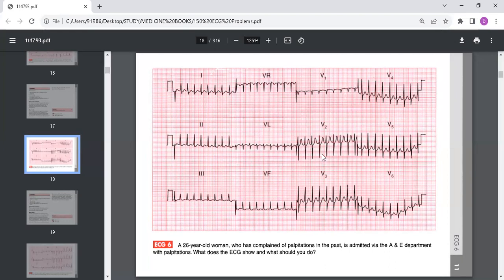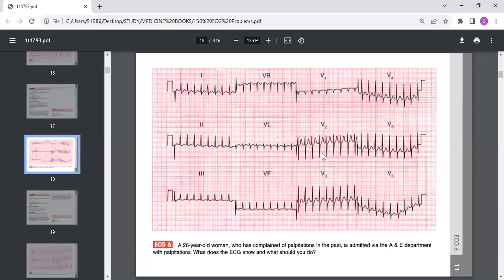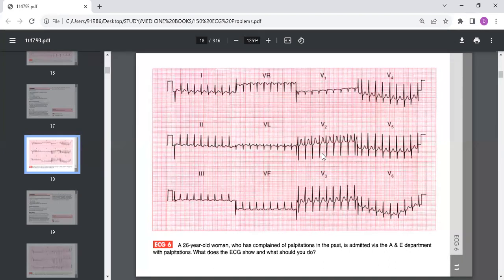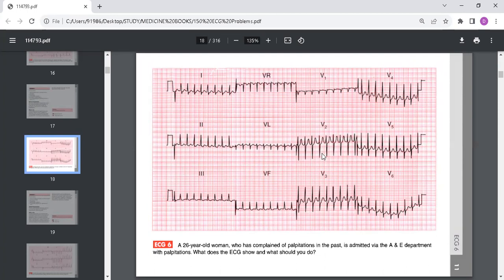This is supraventricular tachycardia. Since there are no P waves visible, this is probably atrioventricular nodal reentry tachycardia or atrioventricular reentry tachycardia. AVNRT is the most common form of paroxysmal tachycardia in young people and presumably explains the patient's previous episodes of palpitations. AVRT, where an aberrant pathway is not evident on resting ECG, is an alternative explanation.